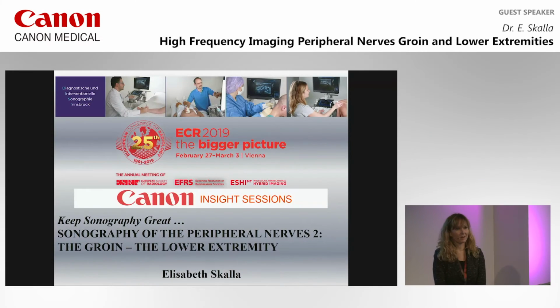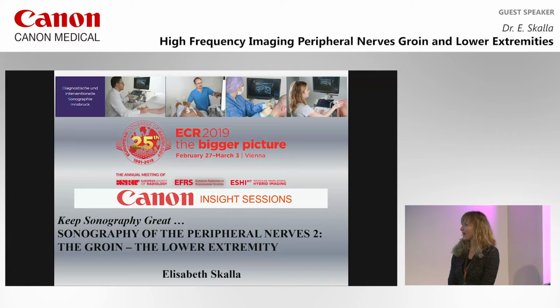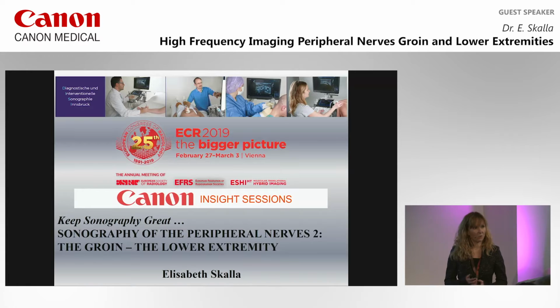Welcome to the second part of sonoanatomy of the peripheral nerve system. In the next hour, I want to show you some nerves of the groin and the lower extremity. We won't manage to do all of them, of course. The time is too short for that, but just a few ones.